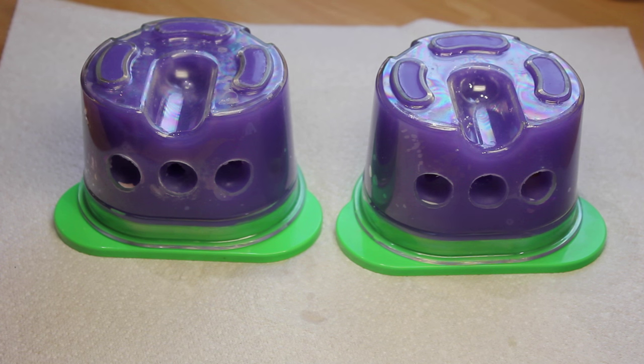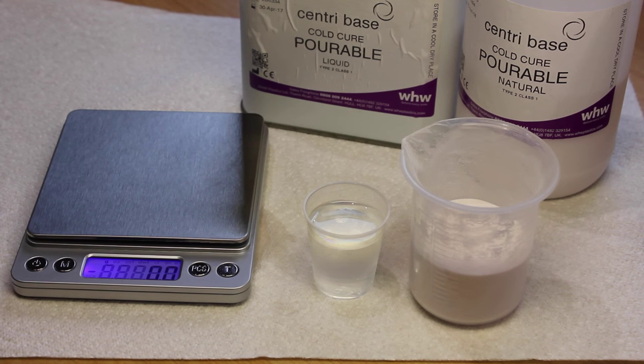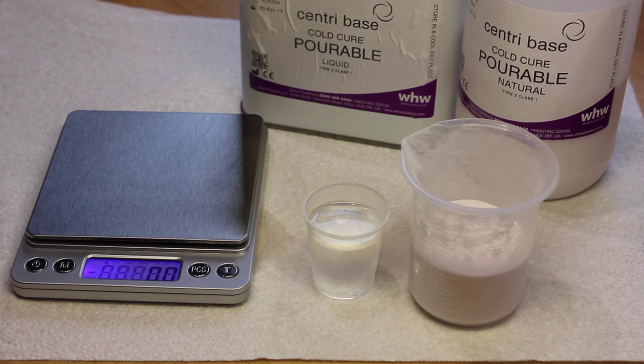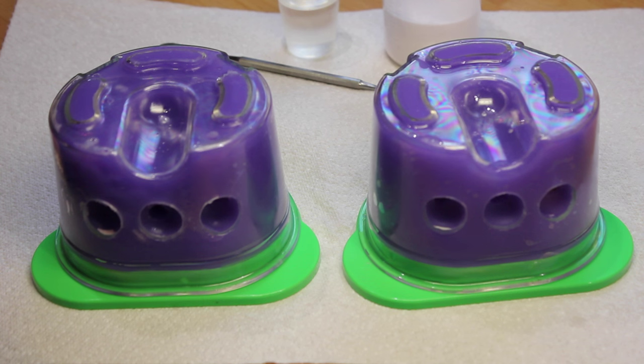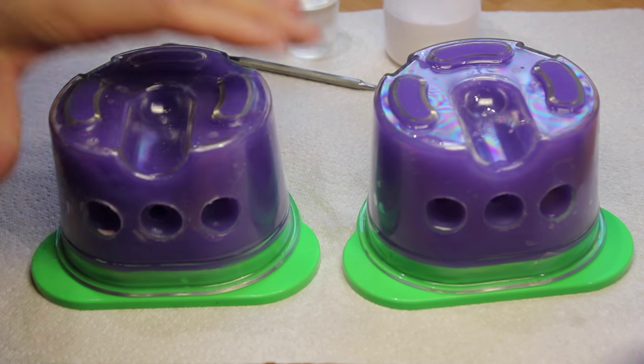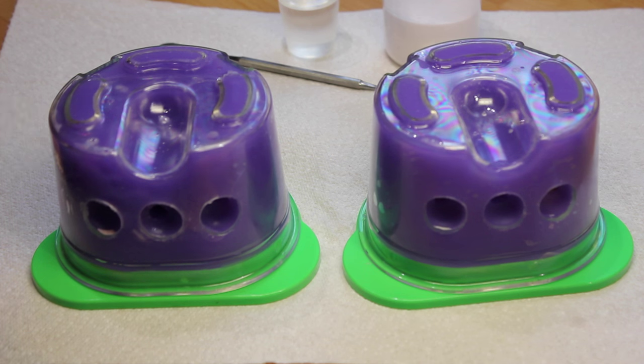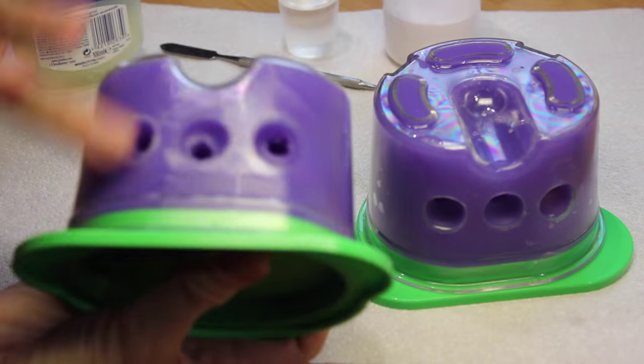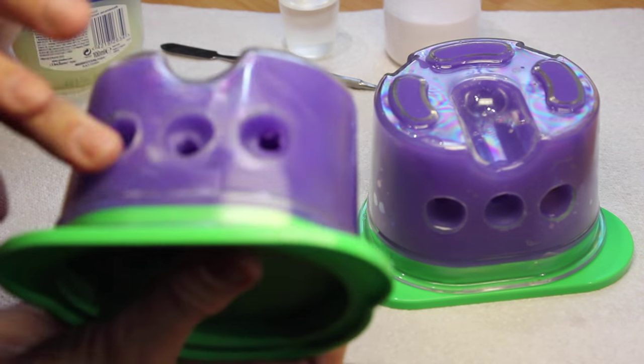We're now ready to mix up the acrylic and pour. I've measured out the powder and liquid according to the manufacturer's instructions. Before you pour the acrylic, it's worth adding a little bit of petroleum jelly to the back of the flasks just in case you miss, as the acrylic sticks really well to plastic.